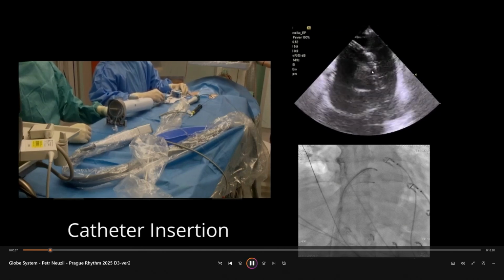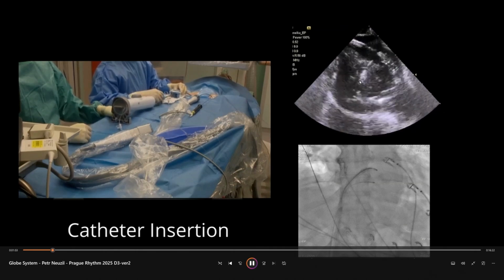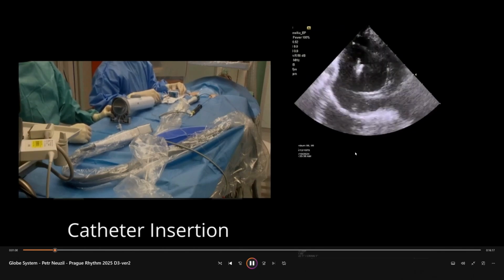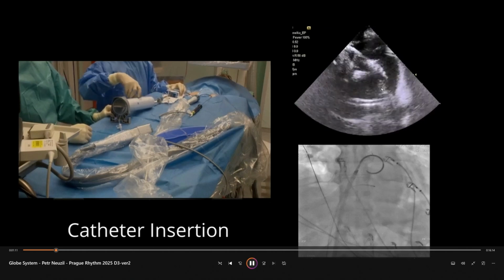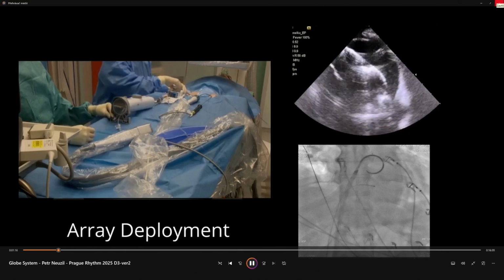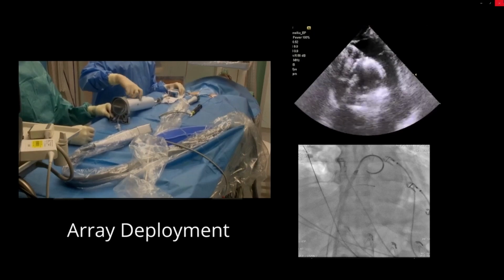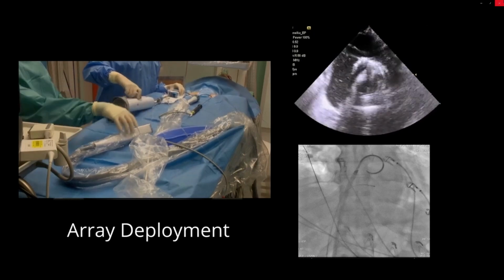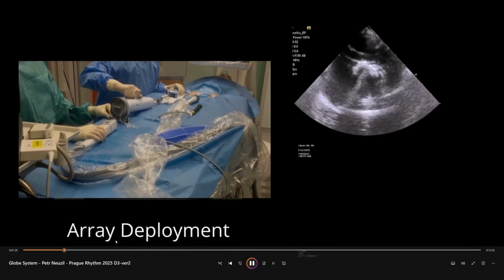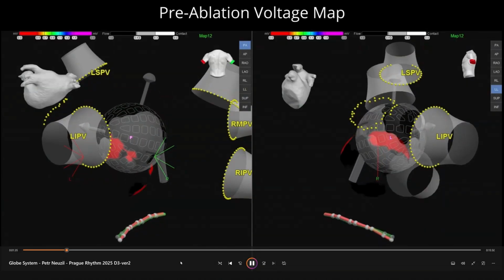Now we're deploying the catheter. Look at that, that's ICE. This is deploying the catheter. We are always using ICE to deploy safely. We can see it on the fluoro as well, but this is critical. We need to be in free space with the catheter, and when we start to insert, we can even control the angulation to be in the free space of the left atrium. So now we need to connect the system with the console to be able to apply the energy.